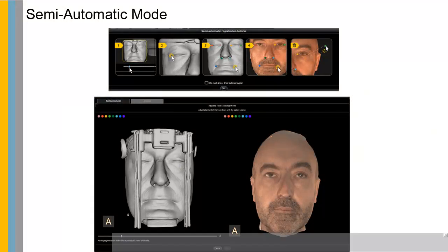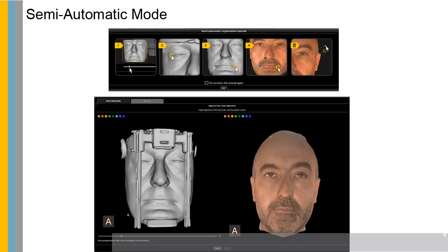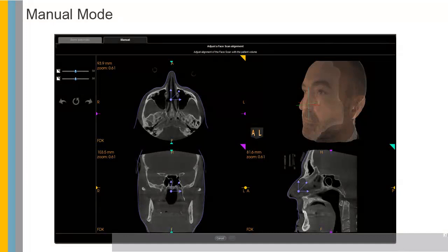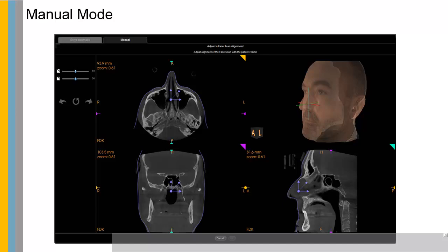Within the Edit Registration Tool, you can select the Semi-Automatic Mode or Manual Tool. When using the Semi-Automatic Mode, a tutorial guides the user to ensure proper registration. The Manual Registration Tool allows for full user control to line up the face scan and 3D volume.